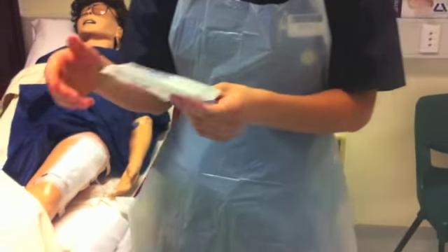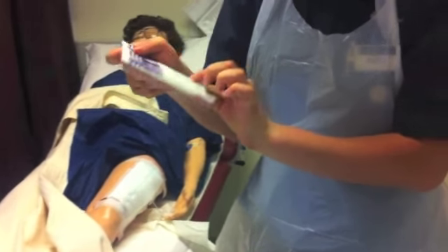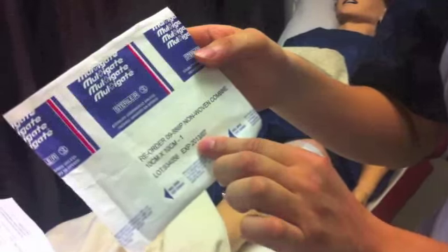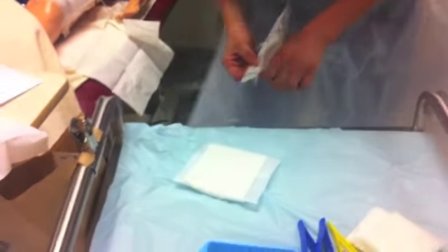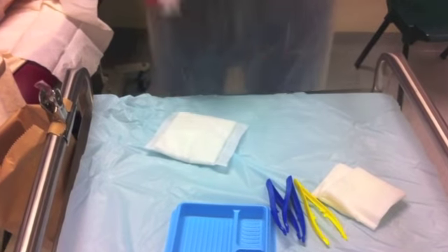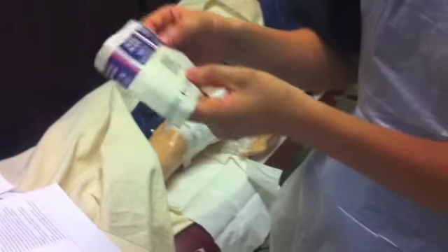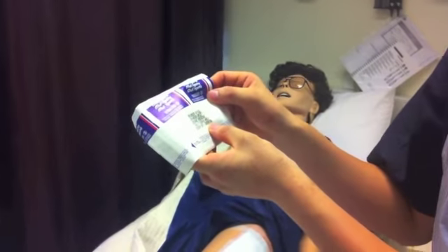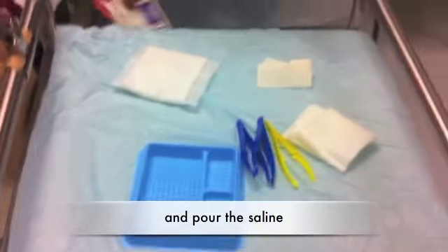Now I'm putting down the large combined dressing. The expiry date is 2013. And the split drainage dressing, expiry date is 2009. Alright.